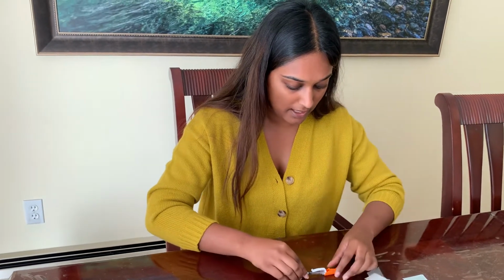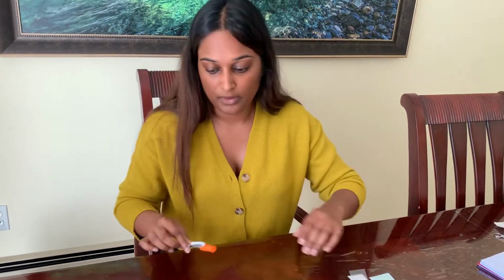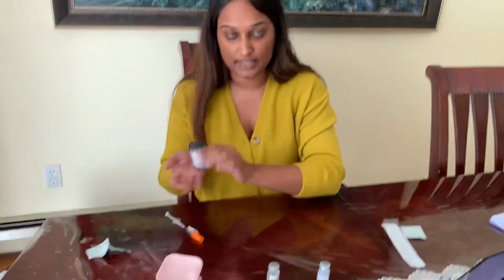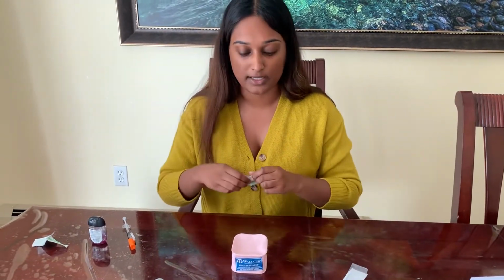So I'm just going to recap. Okay, that's good. So sanitize again before going in. This is my injecting pad. I would make sure I do my patient identification to check their wristband, and I can also ask them their date of birth, first and last name.